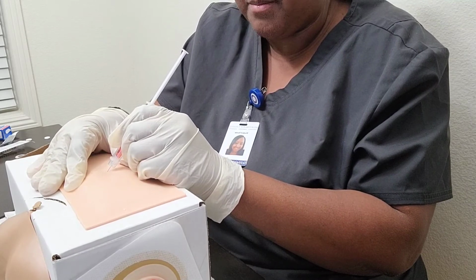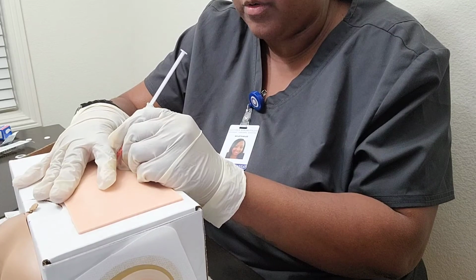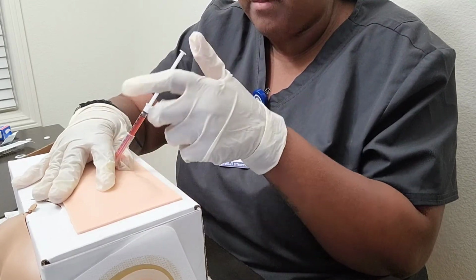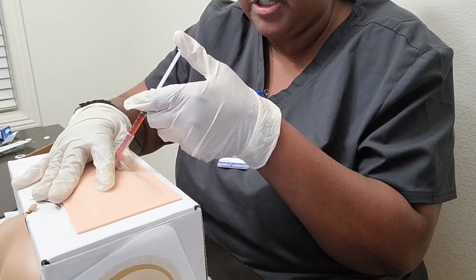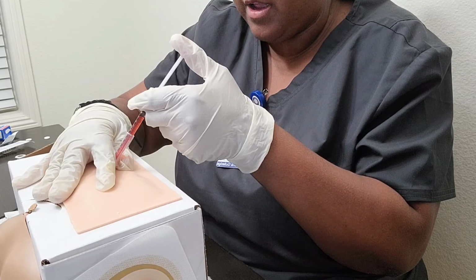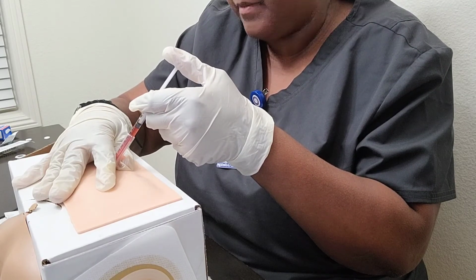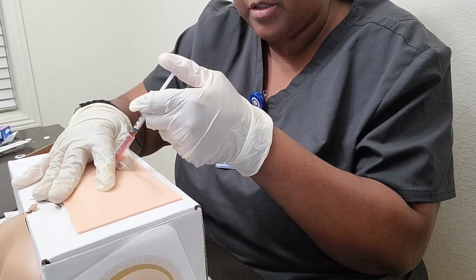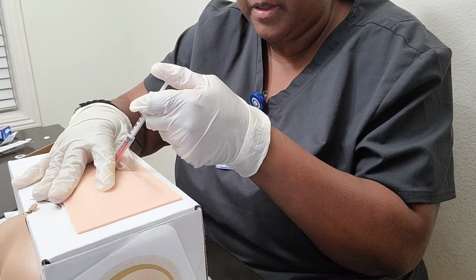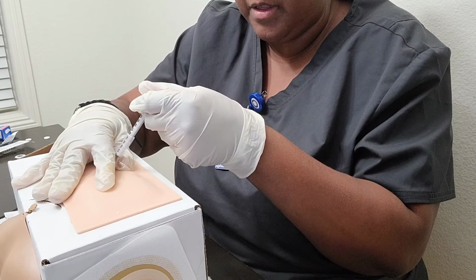Okay, and then with my non-dominant hand, I'm going to go ahead and hold it right here to stabilize it, and then move my dominant hand to the end of the plunger, and then slowly inject the medication over a few seconds. Slowly. Okay.